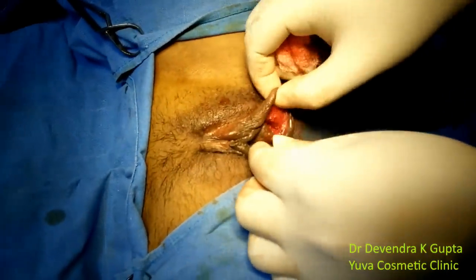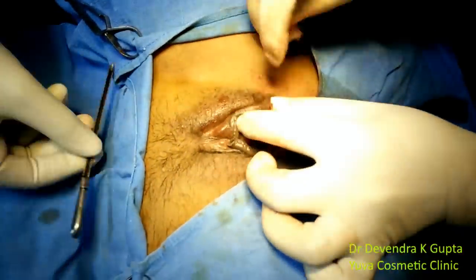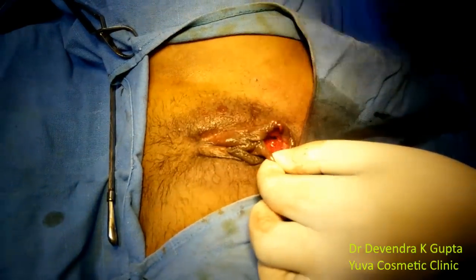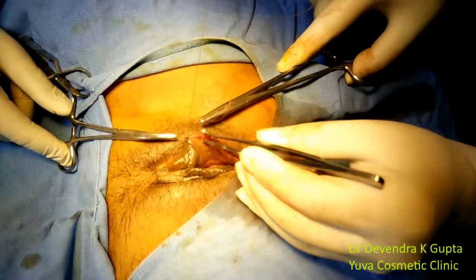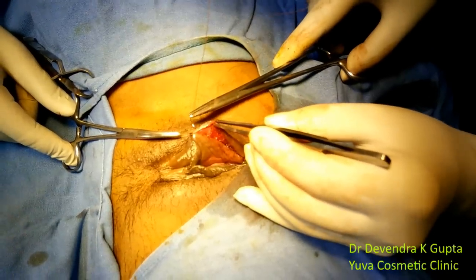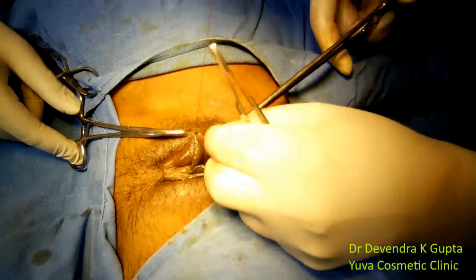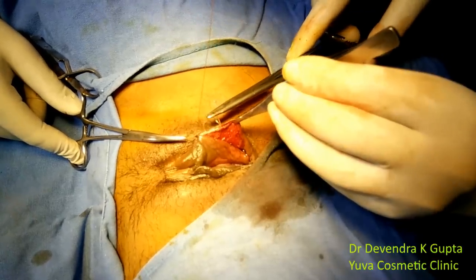Although the epithelial lining is damaged in abscess formation, I am doing a sort of marsupialization by putting some continuous sutures here.